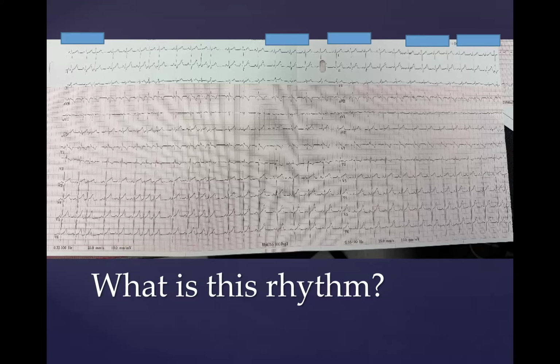A 5 or 6, and the ablation catheter is 7 French. So I think we could make the argument that a 7 French sheath in a 6-year-old is certainly no larger than a 6 French sheath in a newborn.